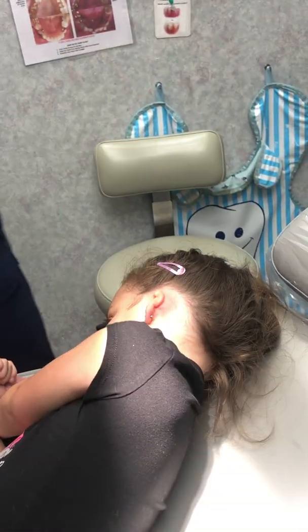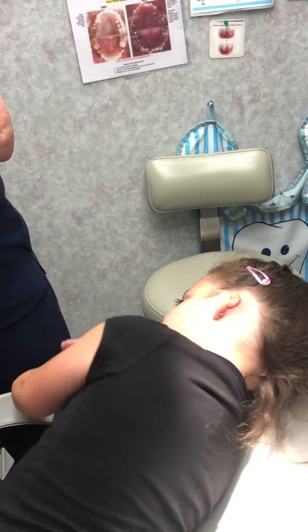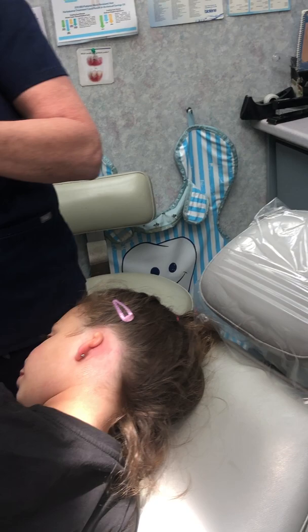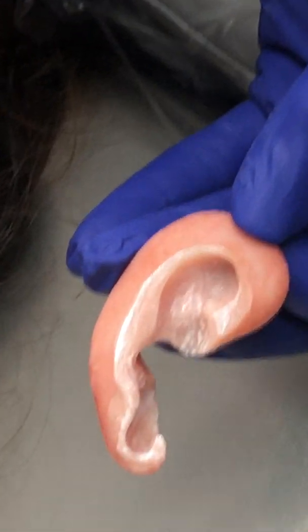I'm going to show Mom what I'm doing. Do you see the area that I'm doing? I'm not doing here, because that's the outside of the ear — that's the part that shows. Only the part that's going to touch skin.